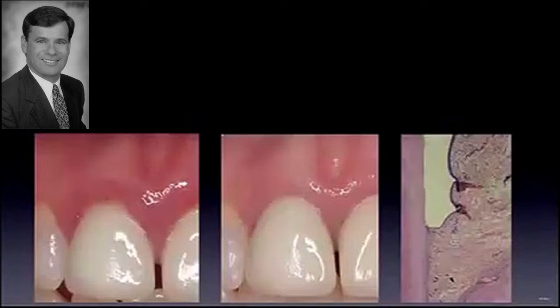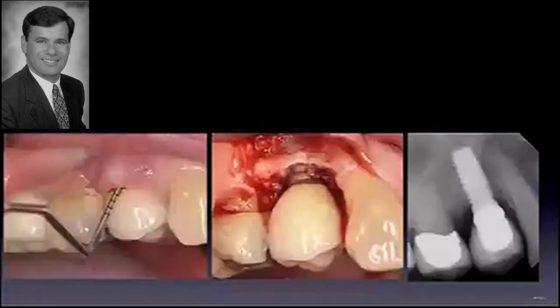Yet it's so ironic that when we think about implant dentistry, particularly some of the implants we've placed for years, we accept a degree of inflammation. We accept a degree of bone loss and chronic issues. In these cases, we lose bone, and they're particularly related to microgap issues and chronic inflammation. As a profession, we've called these implants clinically acceptable. Clinically acceptable. And we have lots of them.